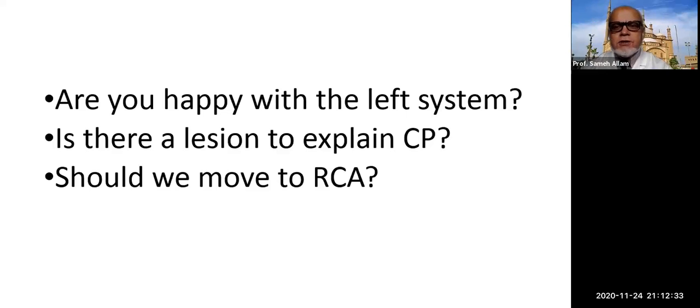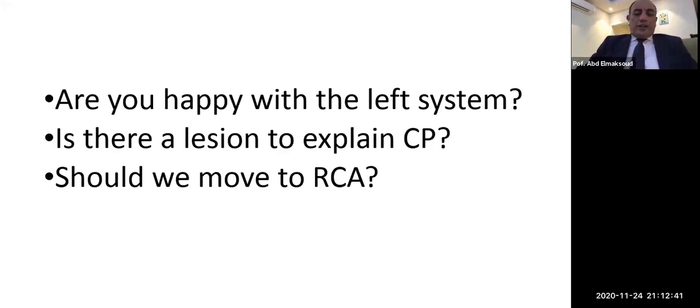Is there a lesion to explain chest pain, Abdul Masood? Actually, as you mentioned, Dr. Sameh, it's a very short left main, and in the LAD, maybe at the distal segment, there is some sort of intramyocardial bridge, so maybe for the meantime this is the cause of chest pain.